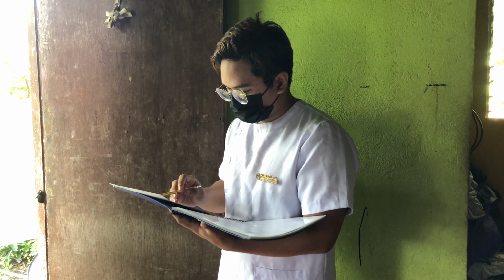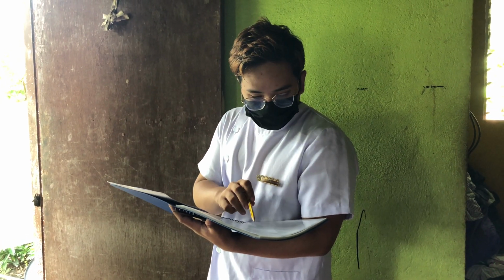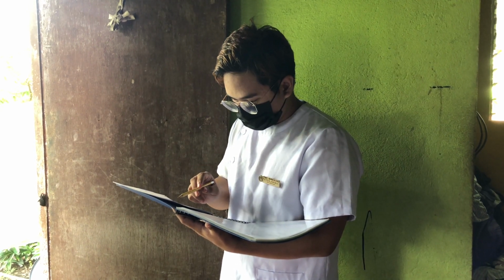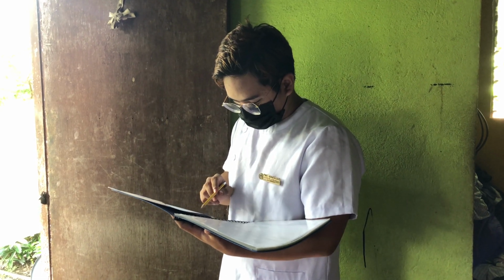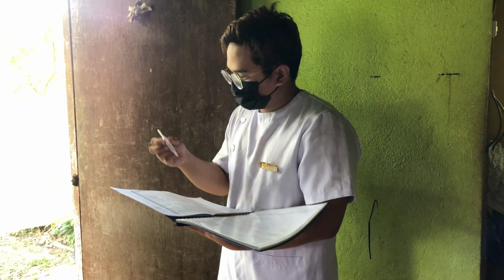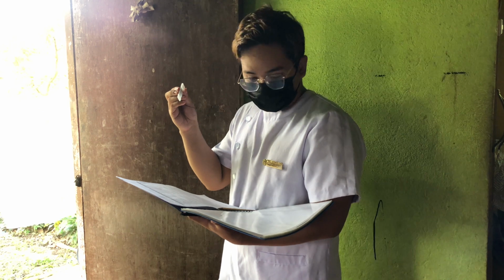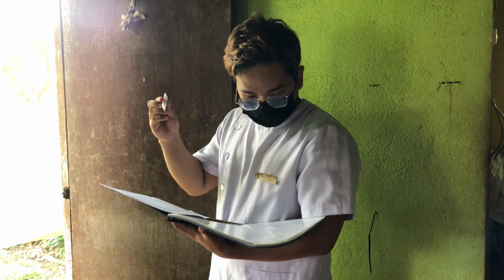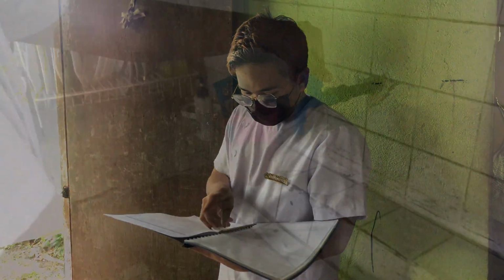Check medication order against the original physician's order according to agency policy. This comparison helps to identify errors that may have occurred when orders were transcribed. Know the actions, special nursing considerations, safe dose ranges, purpose of administration, and adverse effects of the medication to be administered. Consider the appropriateness of the medication for this patient.